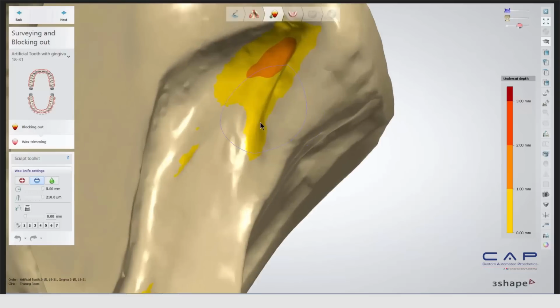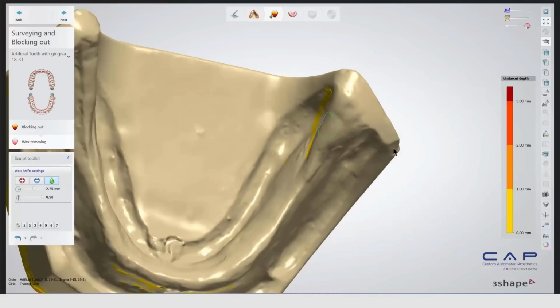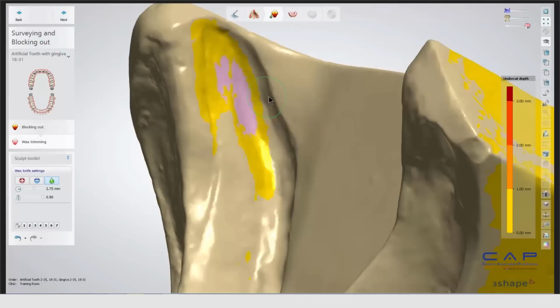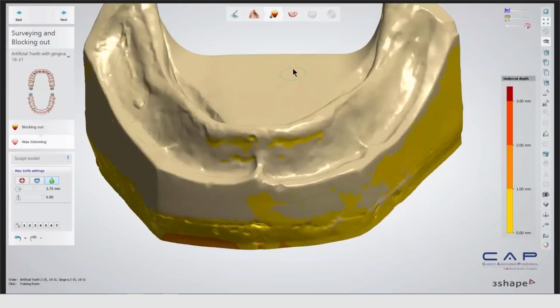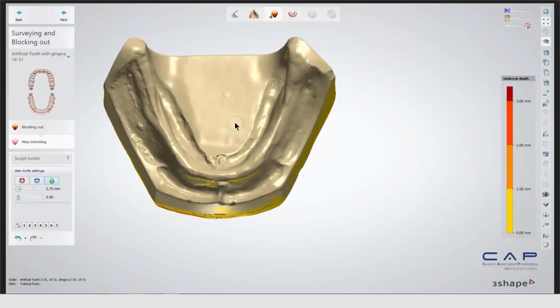So when we go into our wax trimming, what I usually do is take my smooth tool, get a smaller one, and fill in those areas with the smooth tool. That just helps to blend this into that area there. Turn this on just until the orange goes away so that you have the yellow there. Make sure that we're not going to that boundary cut where we had it before so that we're not running into any areas where there'll be sore spots. So now everything else should be either purple or yellow on our boundary lines. And once we have that, we're good to go.